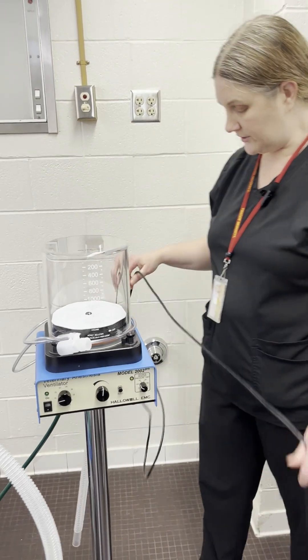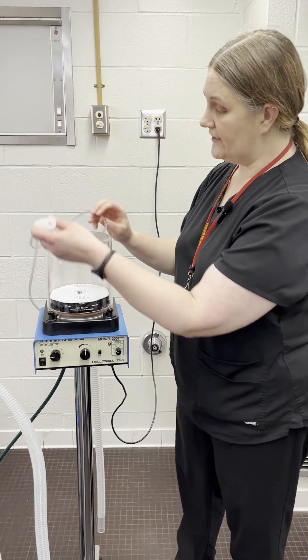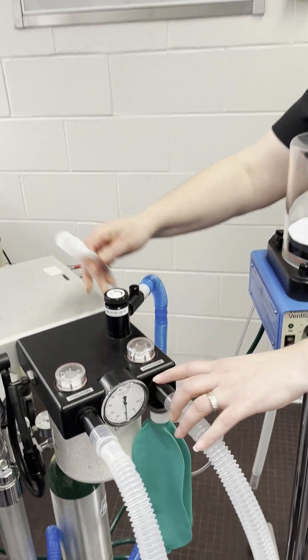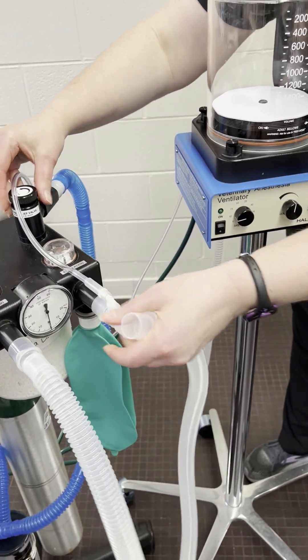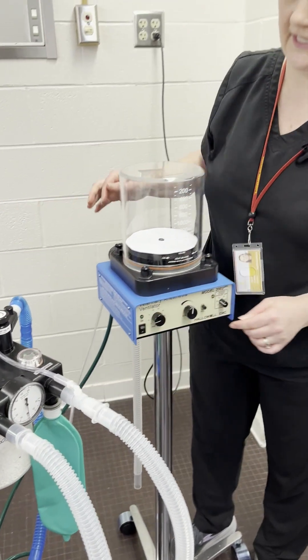It does require to be plugged in, so you need an electrical outlet. And then there is a safety device on here that attaches to either the inhalation or the exhalation one-way valve. This has to be present — otherwise, as soon as you turn on the Hallowell, it's going to alarm and tell you that something is wrong.